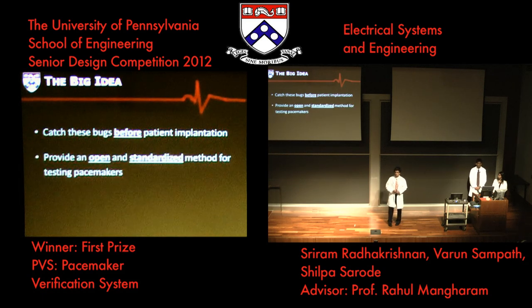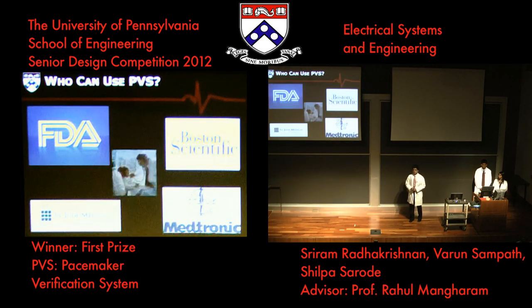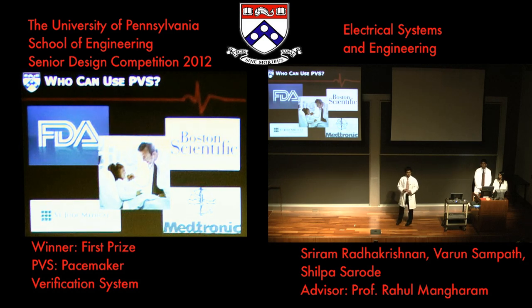If we can make this system open and standardized, then many different organizations can benefit from a system like this. So let's go over some of them. Imagine, for instance, the FDA, which is the body that is in charge of regulating medical devices. What if they could use this system to make sure that all pacemakers hit a common baseline as to what tests they should pass?